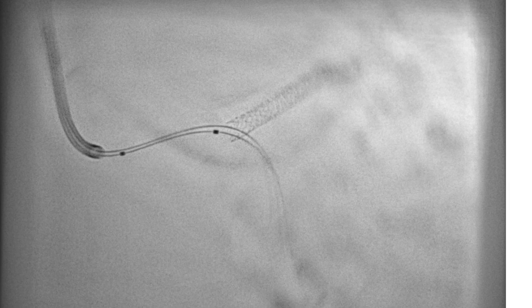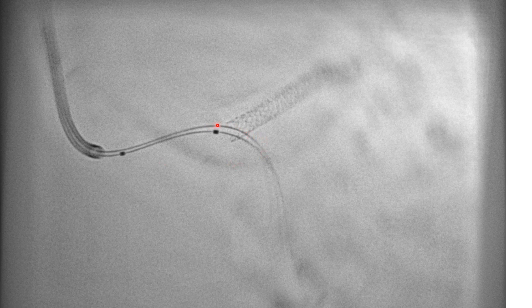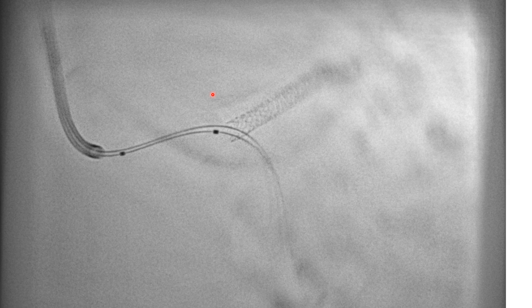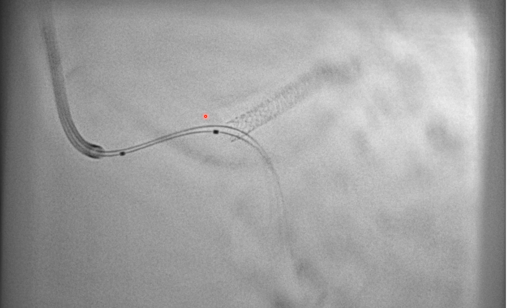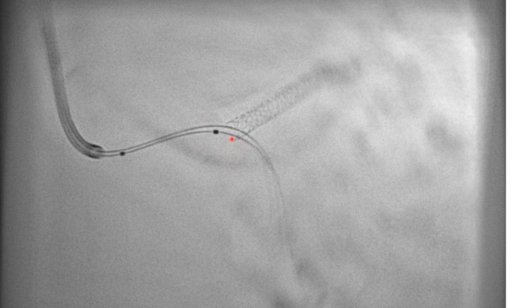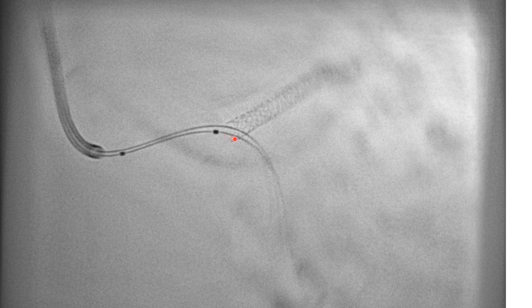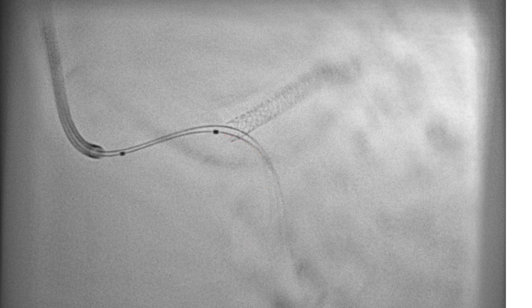Stent enhancement showed that the first wire was actually retrostent at the early beginning of the stent — it was probably under-expanded or too small for the artery size — whereas the second wire passed intraluminally in the stent and then passed into the circumflex.